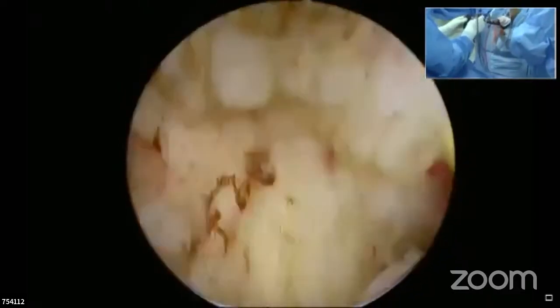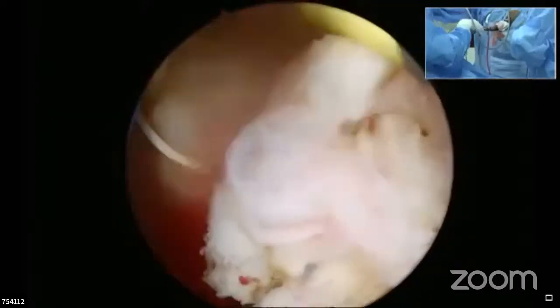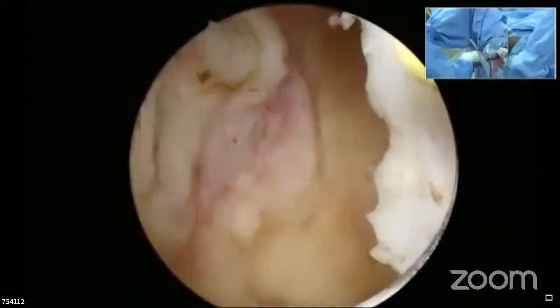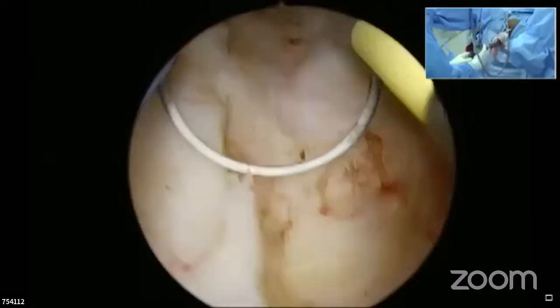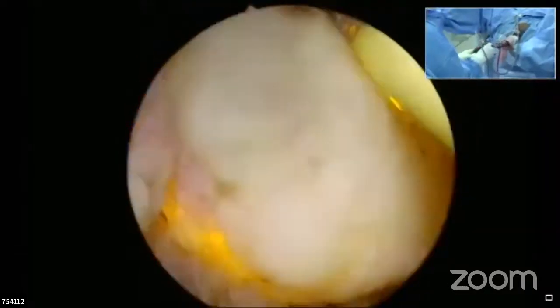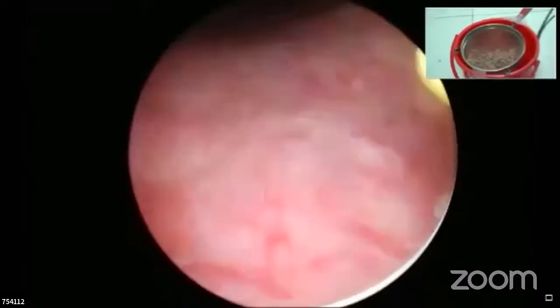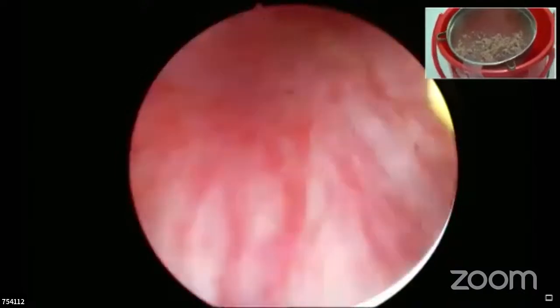Some amount of tissue is remaining behind. So I will have to clear that, shave the prostatic fossa, the shaving of the residual prostate that we discussed. Otherwise, the bulk of the resection is all done. The final shaving of the prostate and hemostasis are remaining. So I would not be dissecting further beyond this.